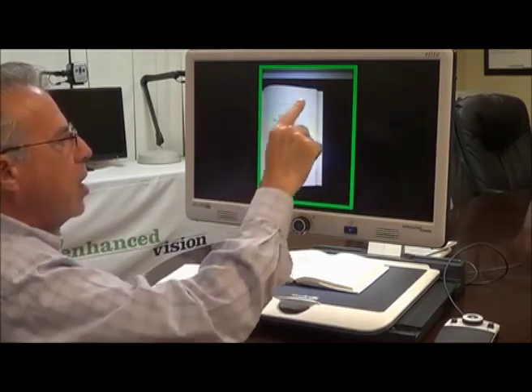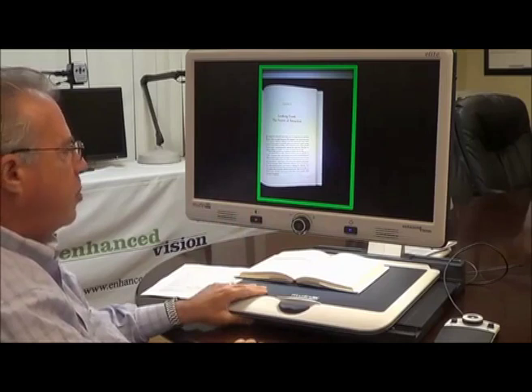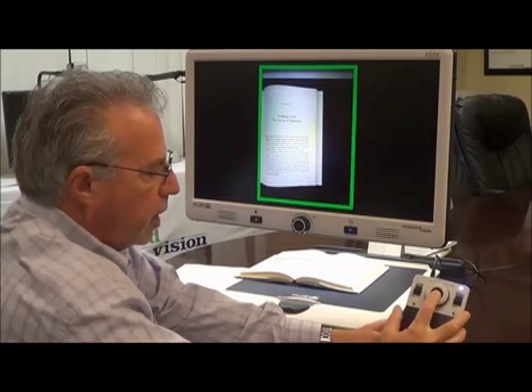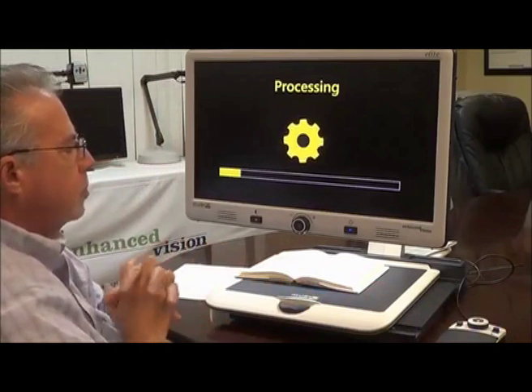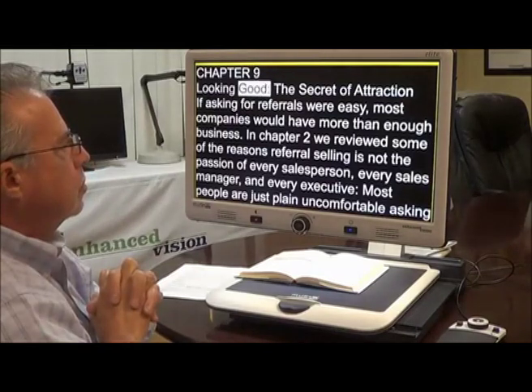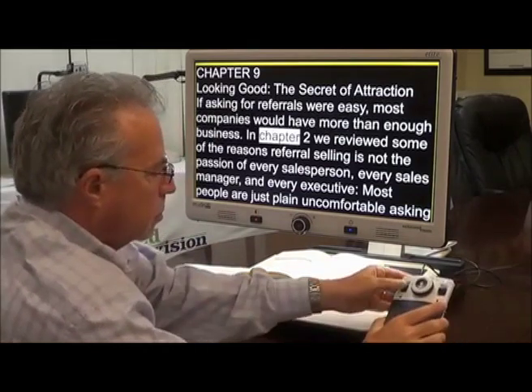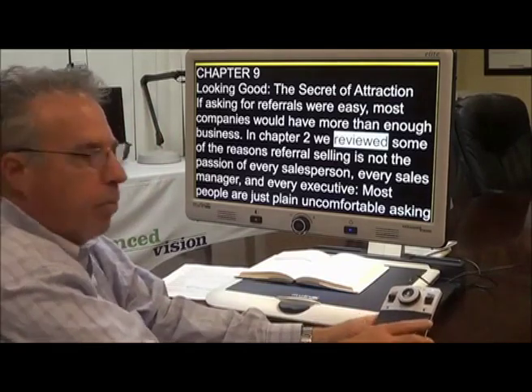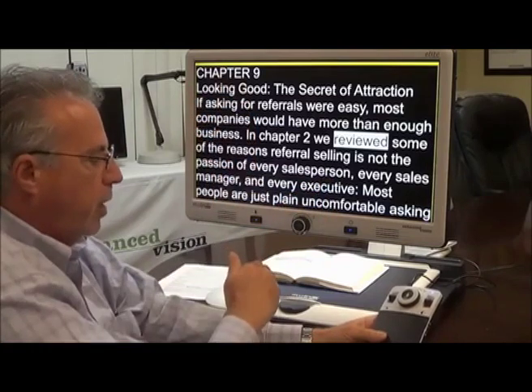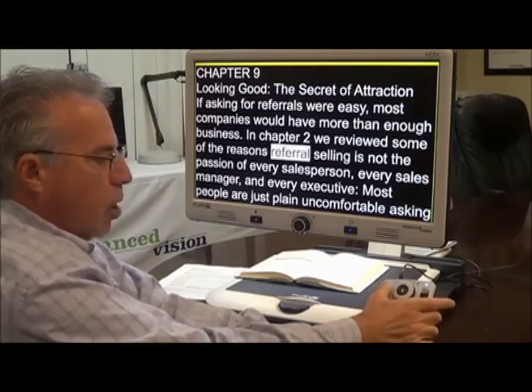In the menu, which I will show you in a moment, you have the capability to change that frame color. If you don't like green, you can change it to yellow or other optional colors. Now in order to scan, I just take the controller and press one button. The device then scans the entire page and starts reading automatically: 'Chapter 9. Looking good. The secret of attraction. If asking for referrals were easy, most companies would have more than enough business.' Using the control panel, I have the ability to pause it and start it again.